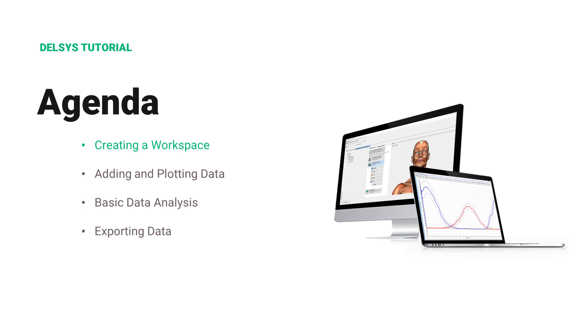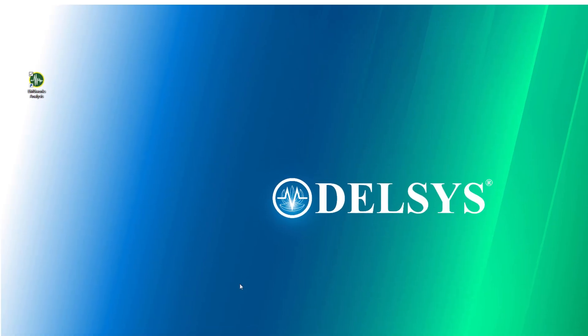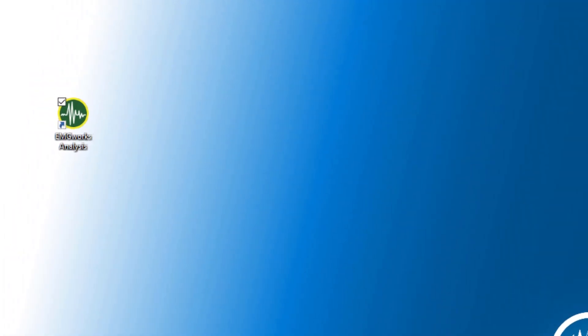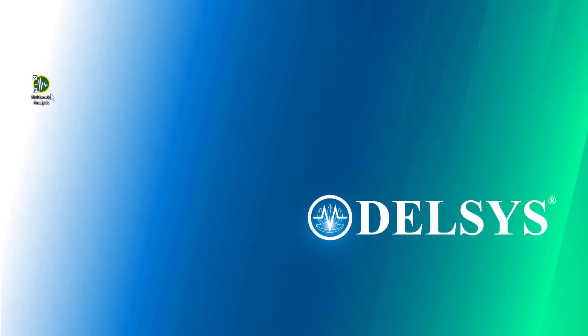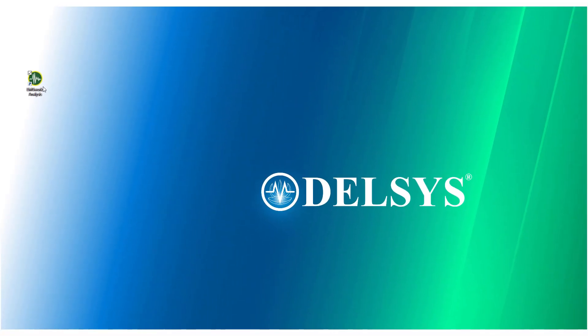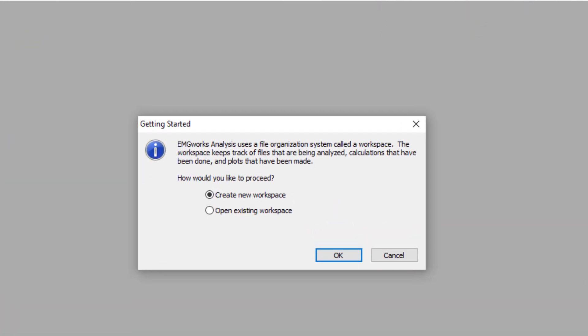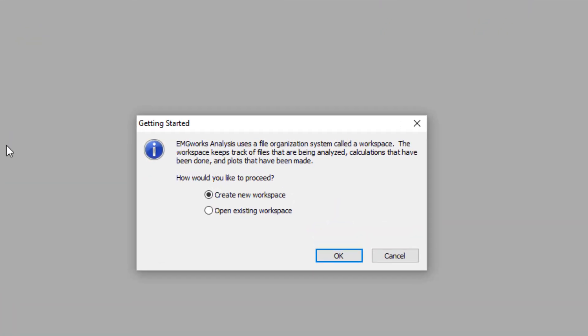To get started with EMG Works Analysis, we first need to create a workspace. To start, open EMG Works Analysis. EMG Works Analysis will be automatically installed when downloading the EMG Works software package.